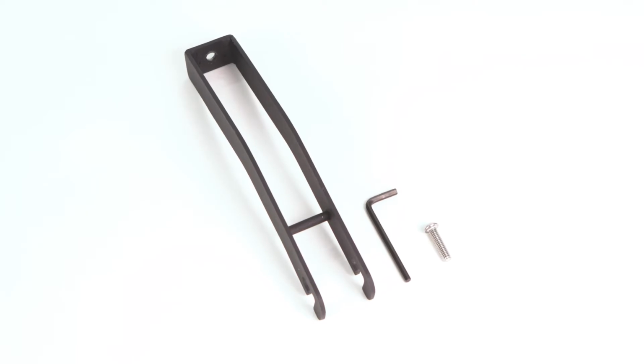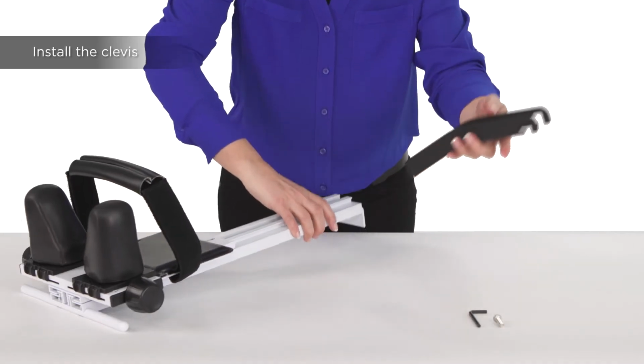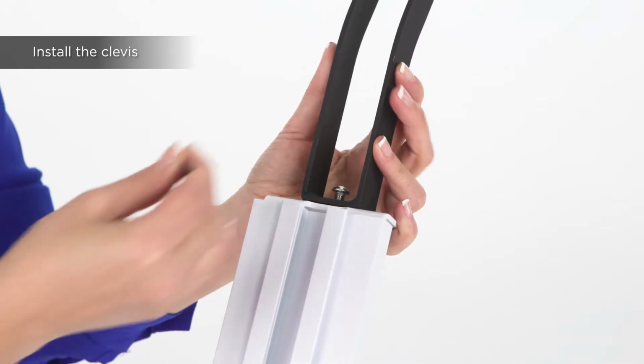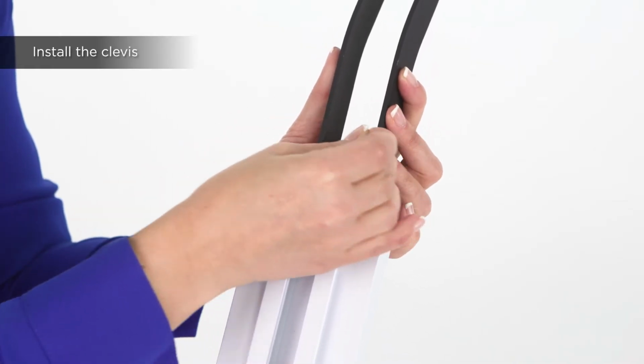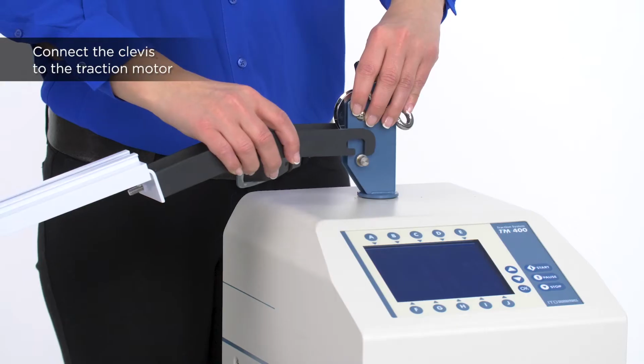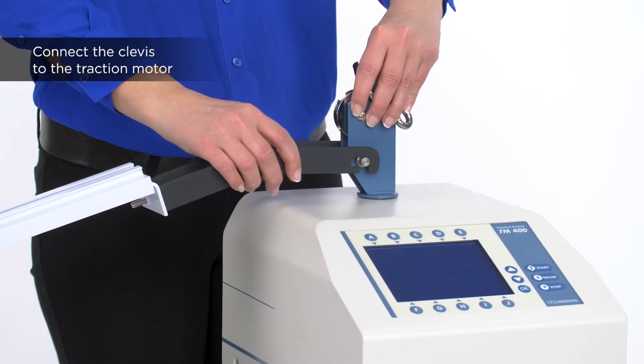With the Allen key and screw provided, secure the base of the clevis to the top of the Saunders clinical traction device rail. The clevis required will depend on the brand of the traction motor being paired with the device. Securely hook the opposite end of the clevis to the connectors on the traction motor.